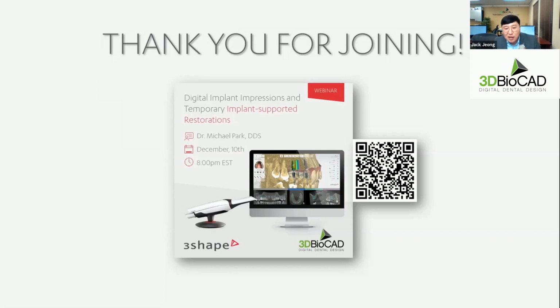The question is just gone. I just try to read more here. But if it keeps delaying, you can just ask the lab, or if you are the lab, you can call your support and ask. There is a way we can directly download the Trios file from the 3Shape Communicate site. So if it's not coming into your dental system correctly on time, you can download it directly from the 3Shape Communicate site. If you don't know how to do it, please call the support team with your vendor, okay?